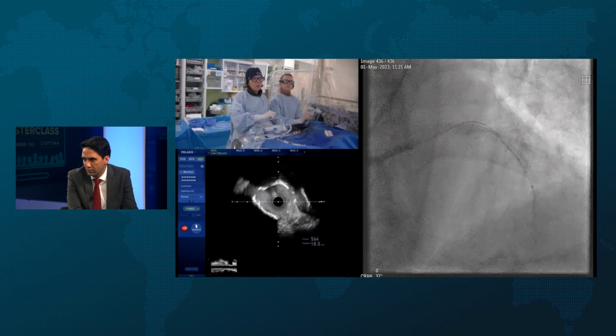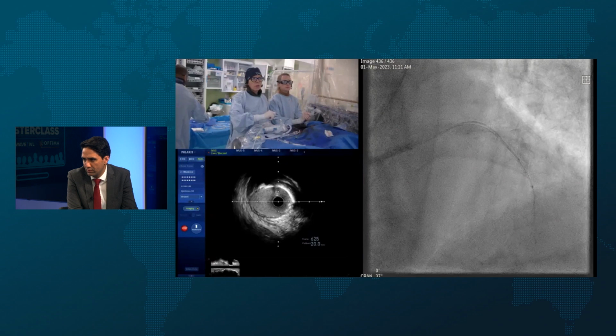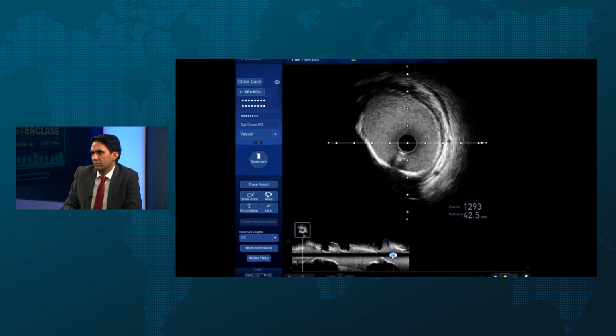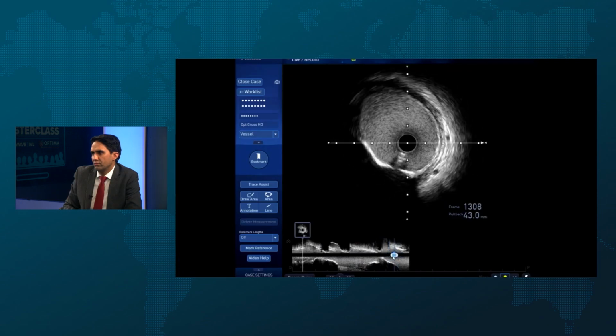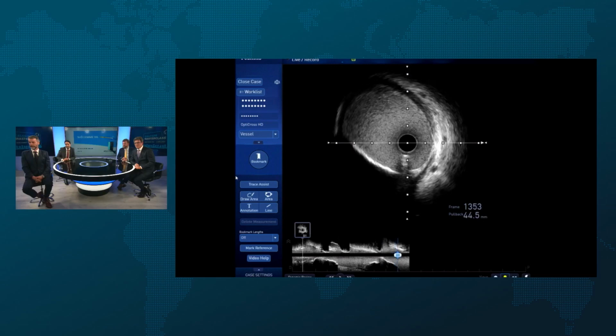Lovely. Nice picture. It's great. Another 2,000. Yeah, that looks like it's going to be pretty good. 38. Let's go to, yeah, there we go.